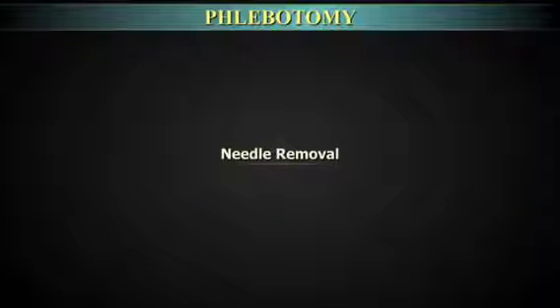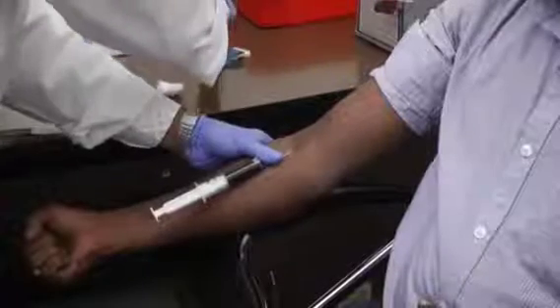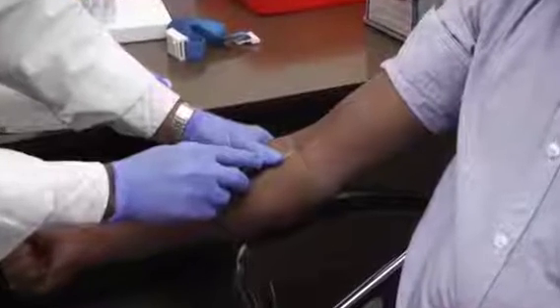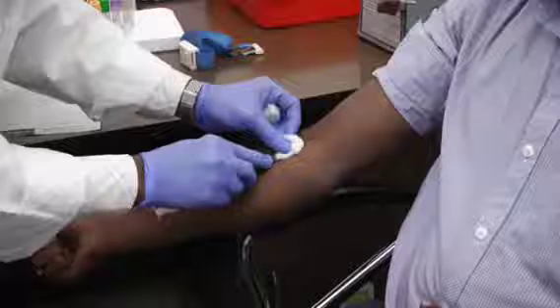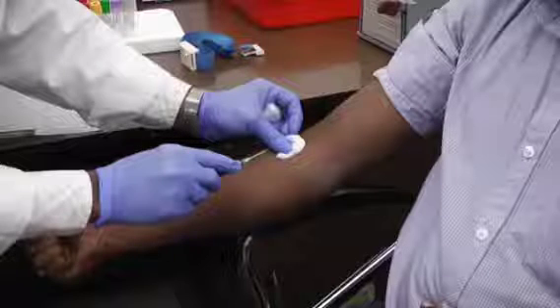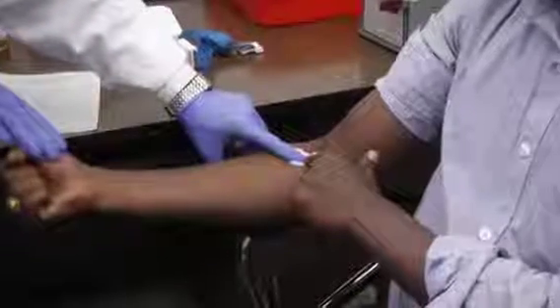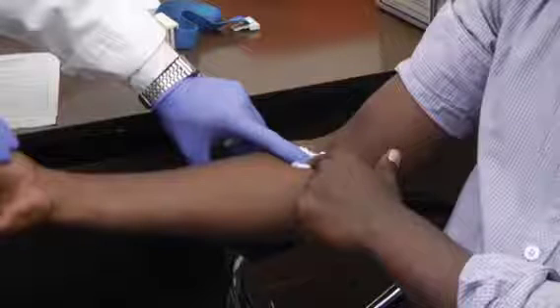Needle removal. The tourniquet must be fully released and the patient's hand opened and relaxed before the needle is removed. Hold a dry cotton or gauze pack over the site. Gently and quickly remove the needle from the arm, and as soon as the needle is removed, pressure must be applied to the site to avoid leakage of blood and hematoma formation.